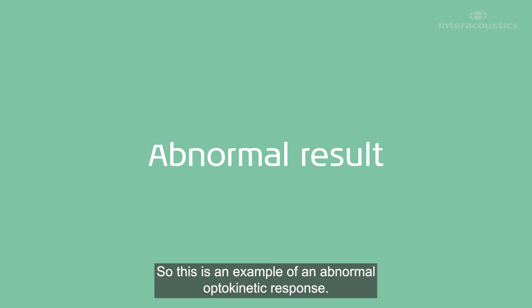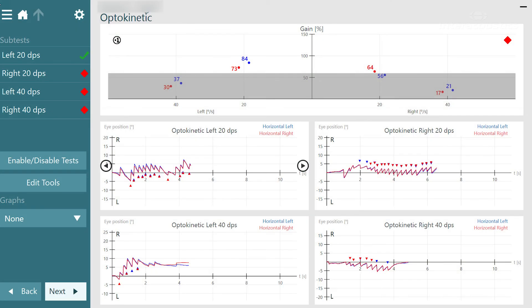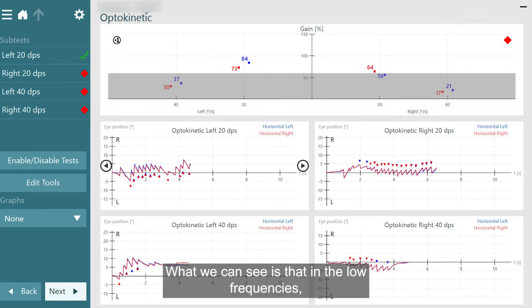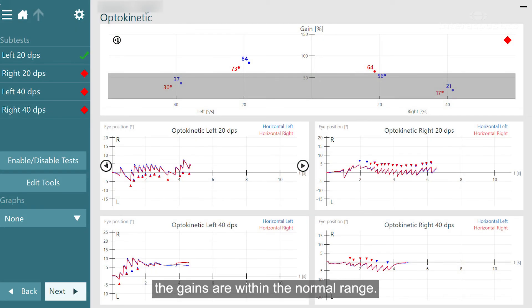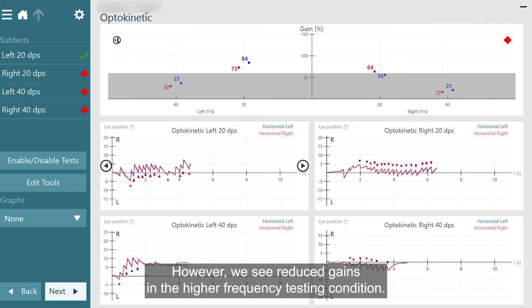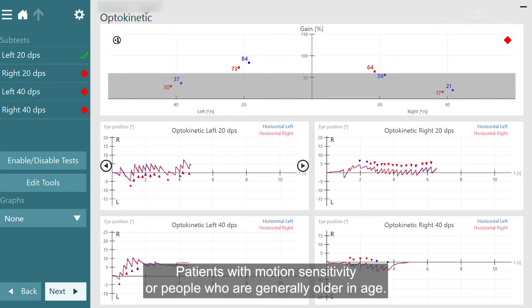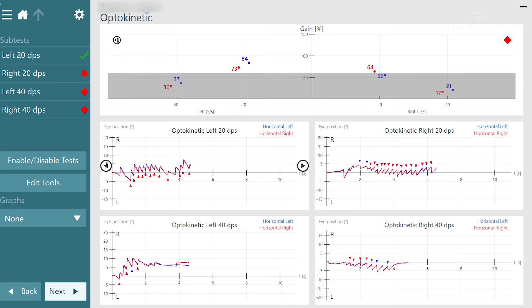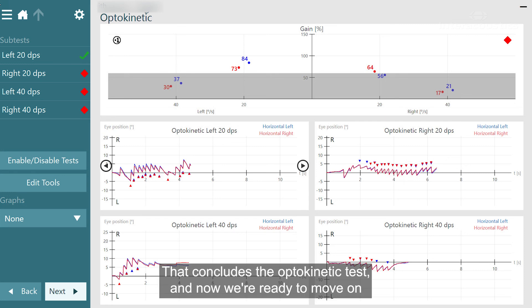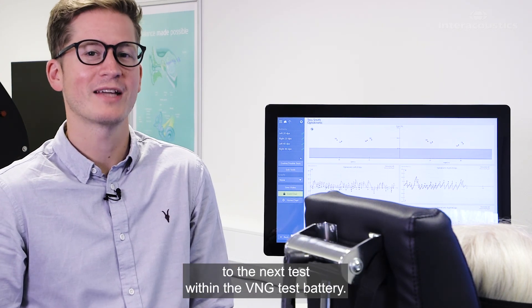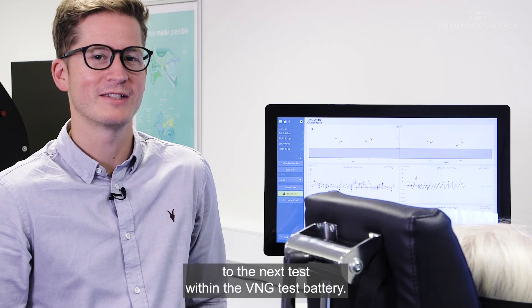This is an example of an abnormal optokinetic response. In the low frequencies the gains are within the normal range; however, we see reduced gains in the higher frequency testing condition. This can be seen in central patients, patients with motion sensitivity, or people who are generally older in age. That concludes the optokinetic test, and we're now ready to move on to the next test within the VNG test battery.